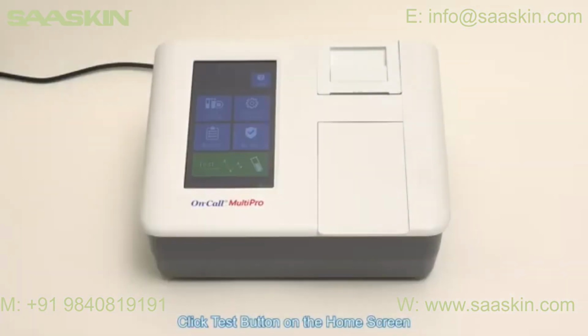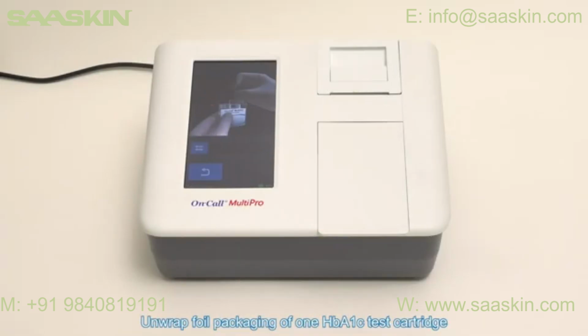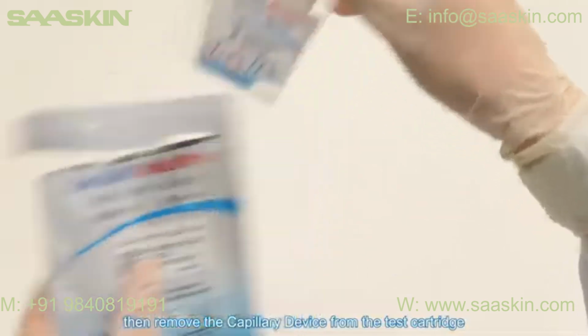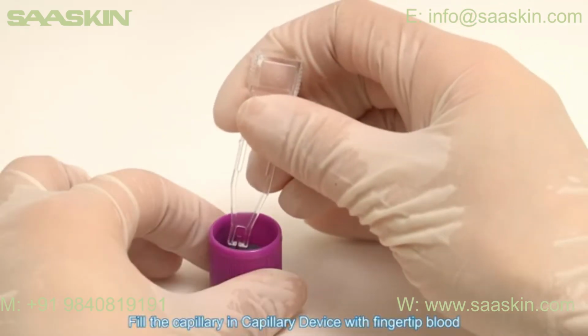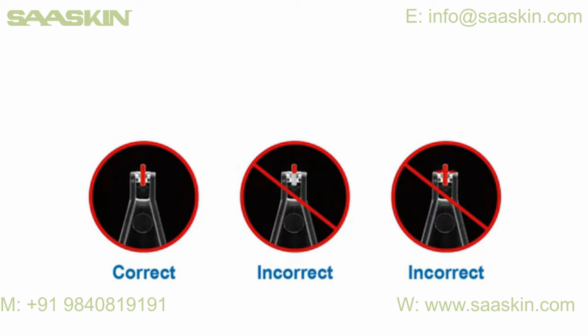HbA1c test. Click Test button on the home screen. Unwrap foil packaging of one HbA1c test cartridge. Then remove the capillary device from the test cartridge. Fill the capillary in capillary device with fingertip blood or venous whole blood from tube cap.